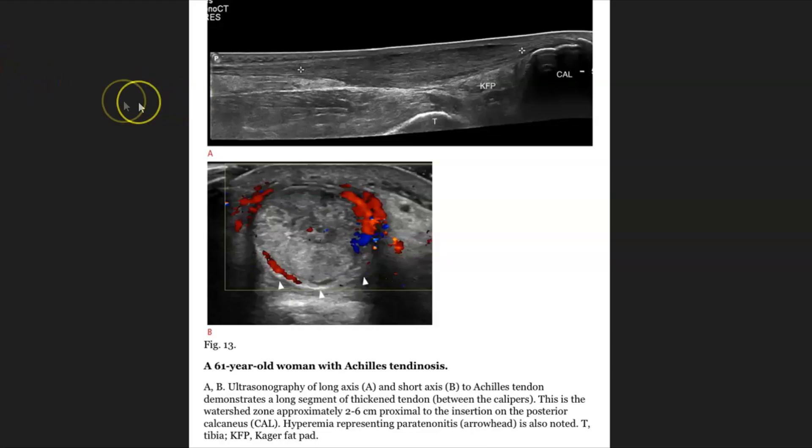And here from the Journal of Ultrasonography, we have a longitudinal panoramic image of the Achilles tendon showing some thickening and hyperemia, consistent with tendonitis of the Achilles tendon.